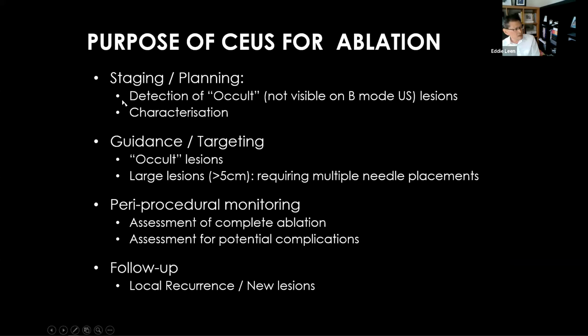It's also very important to use the technique from the point of view of targeting. Given that ultrasound is real-time imaging, with the use of CEUS we can actually identify and target the needle into those occult lesions.